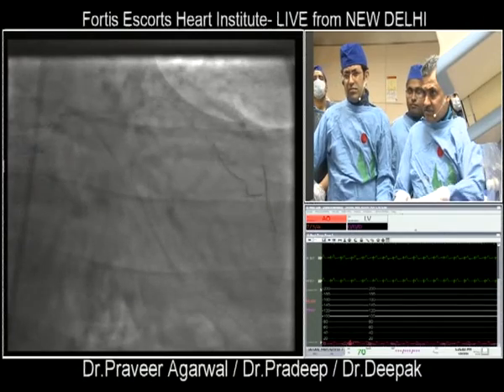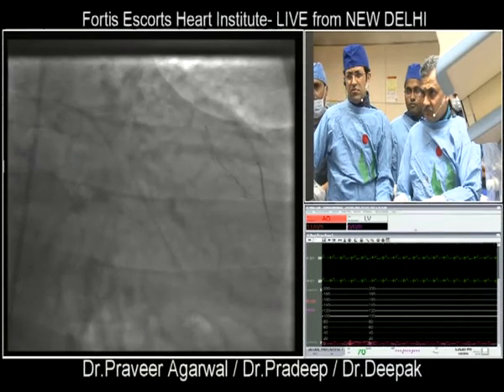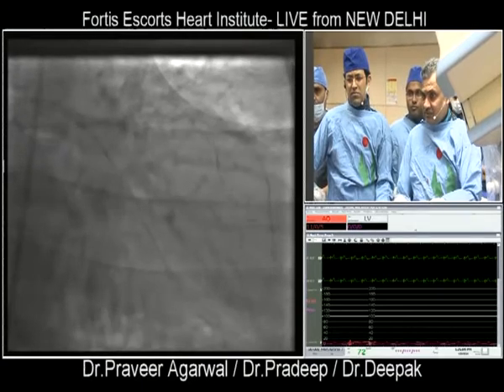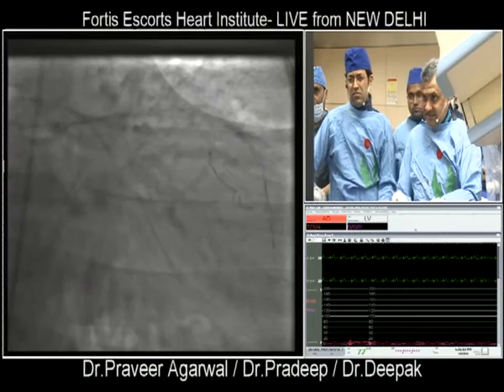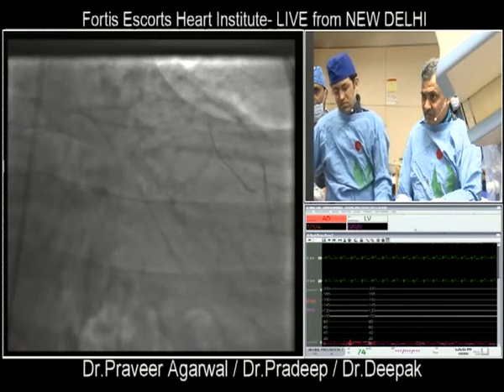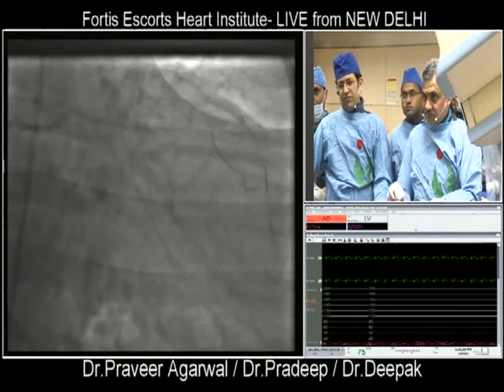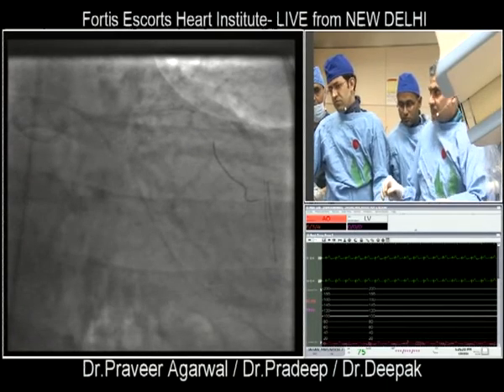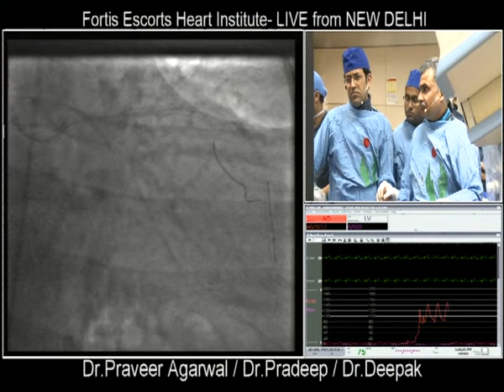Any suggestions? Guideliner. I think also guideliner at this level. I really think that the problem is the proximal stent. So if you can pass that with the guideliner, not on the proximal stent. I'm not sure if you pass with the guideliner. Oh, you can anchor. You can anchor with the balloon distally and you bring the guideliner in. The guideliner, I think, will pass.